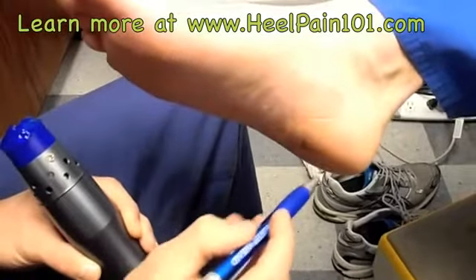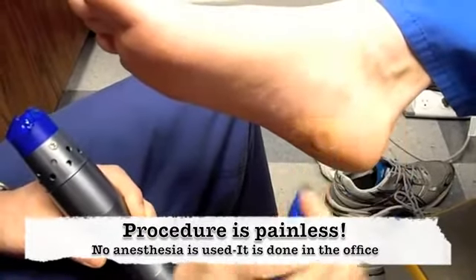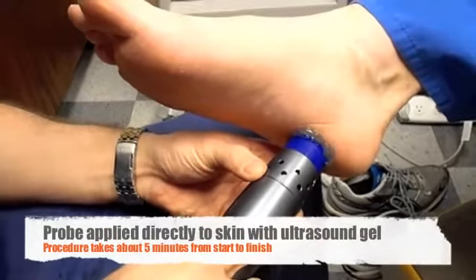Then we use ultrasound gel and a probe that's connected to our shockwave machine. This shockwave machine sends sound waves deep into the soft tissue and penetrates the plantar fascia.